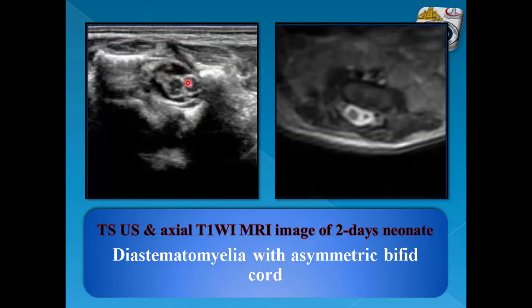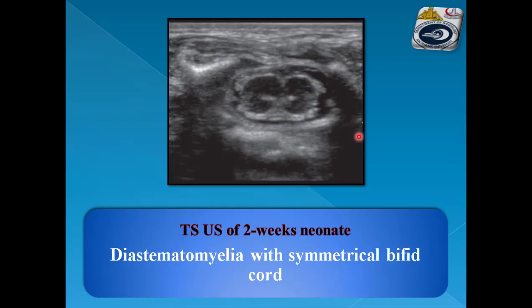On this TS ultrasound image there are two spinal cords divided — asymmetrical division where one is larger than the other. This is confirmed by the axial T1-weighted MRI image. Another example shows symmetrical division of the spinal cord into two cords, denoting diastematomyelia.